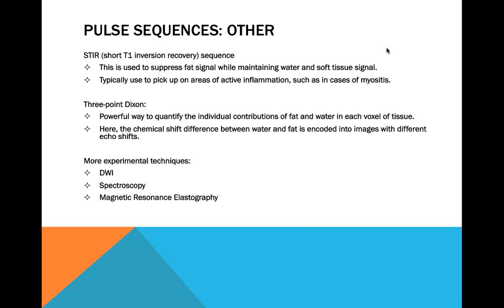Yes. Okay, sorry. So then if you were to take it where you have a patient that has a lot of fat signal in the T1, for example, that fat can sometimes show up even though there is no inflammation in there, and it's a little confusing. And there are some other problems with MRIs that I won't get into, but in all, it's really great to use STIR to suppress fat and try to pick up on water, but it's not necessarily the most accurate study to do. So efforts have been made to use additional studies.